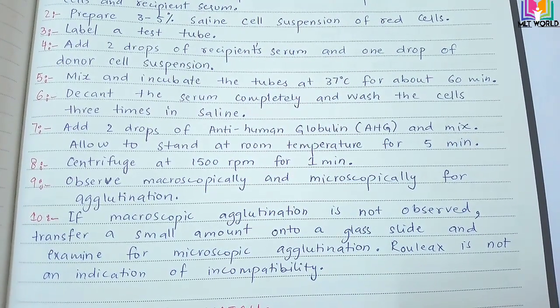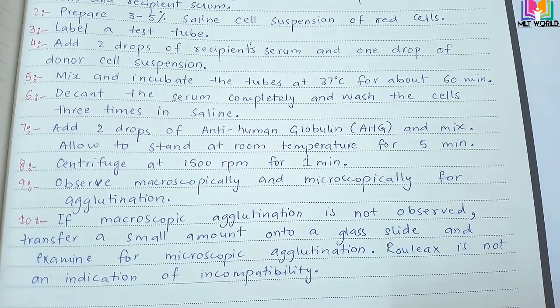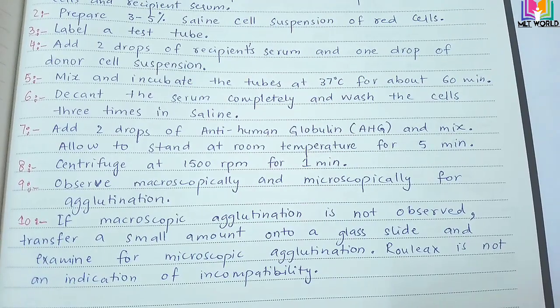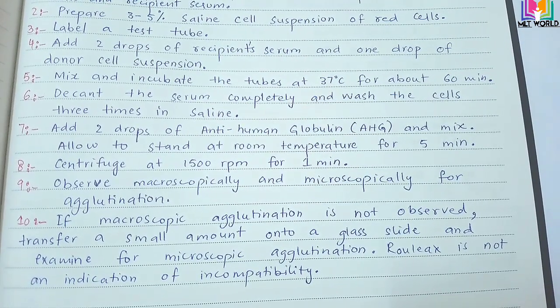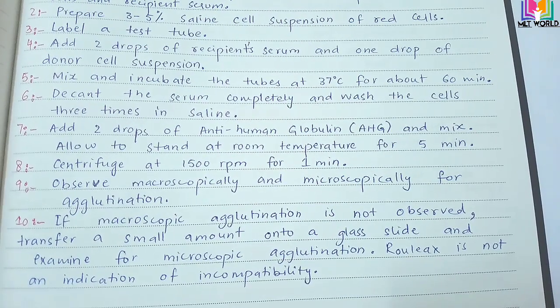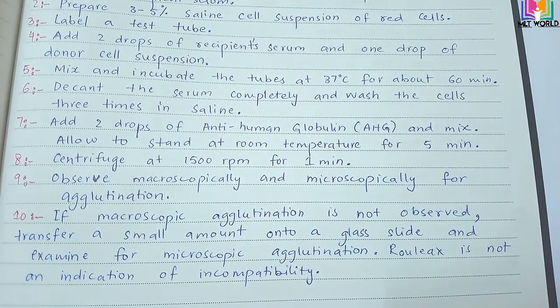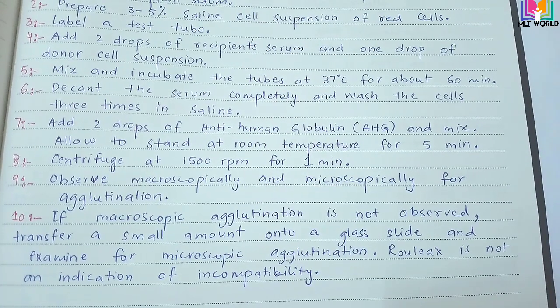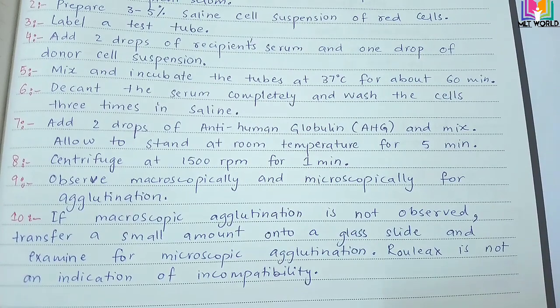So only that agglutination means that blood is incompatible. Otherwise, if there is no agglutination, it means blood is compatible and we can transfuse donor blood to the recipient. But if there is agglutination, it means there is incompatibility and we cannot transfuse this donor blood to the recipient.